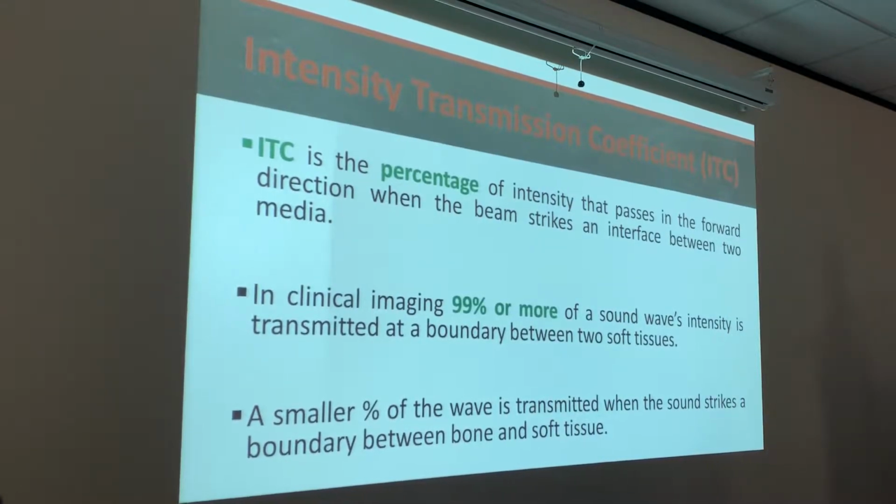You're going to get the most anterior reflection, just like you see with the stone, right? You always see that anterior reflection of the stone, but you don't see the whole shape of the stone. So you're going to see the most proximal part of the stone, or the part of the bone that's most superficial. That's why you can see the outline of the bone, but you can't see the whole shape, because the sound is not going to be able to penetrate that to give you a reflection back.